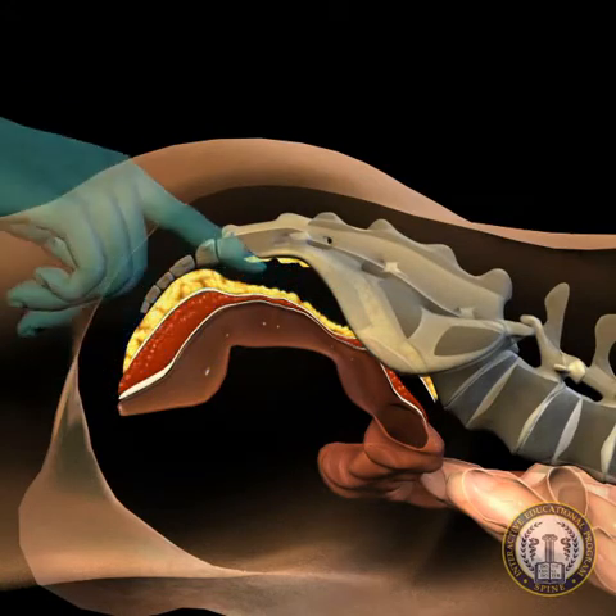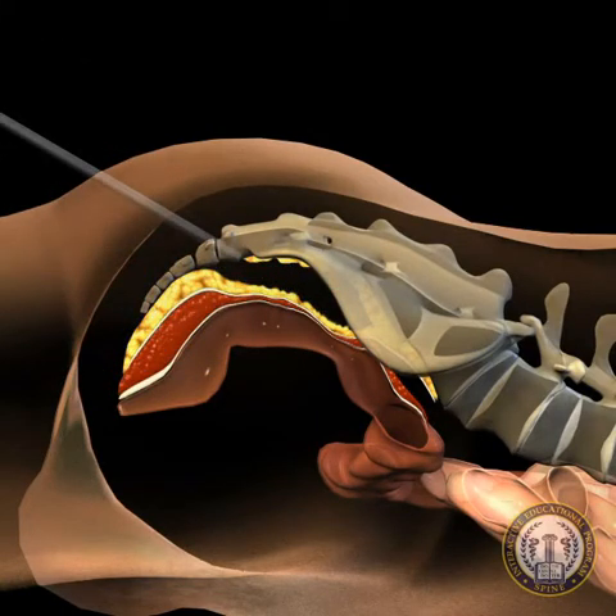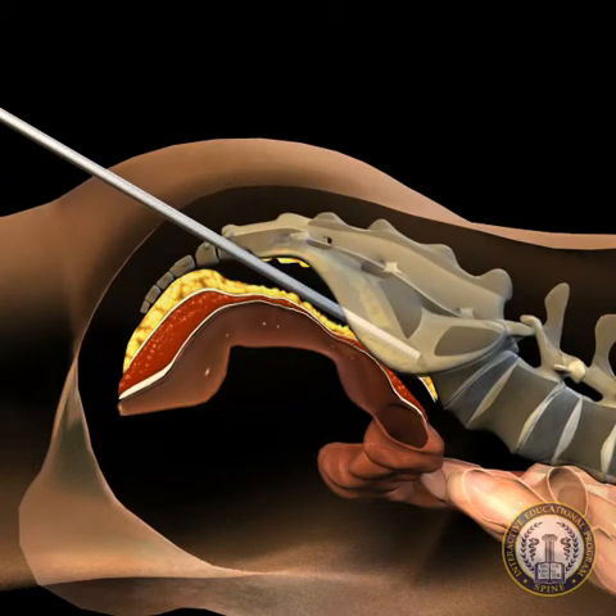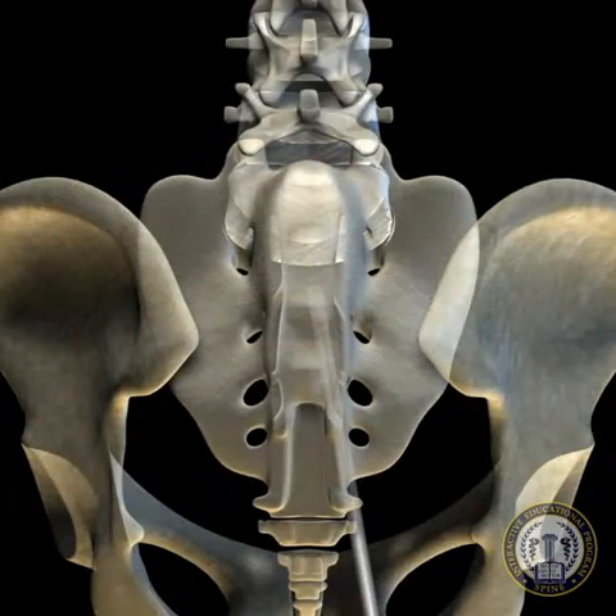Once this interval has been bluntly and safely accessed, a blunt cannulated trocar may be introduced and under biplanar fluoroscopy advanced up the anterior surface of the sacrum to the S1 to S2 junction near the midline. Maintaining the midline is essential to avoid the bifurcated vascular and neurologic structures anterior lateral to the sacrum.